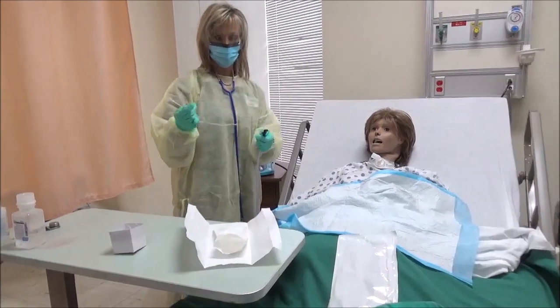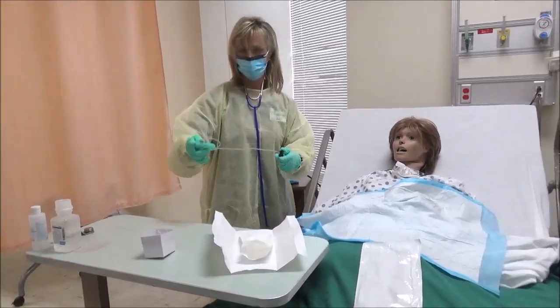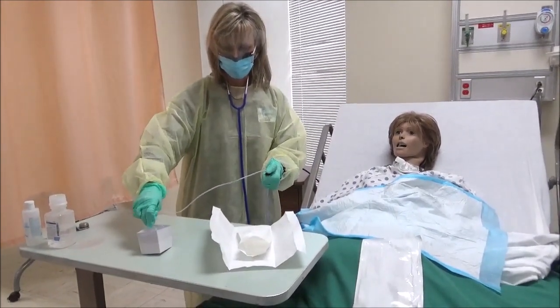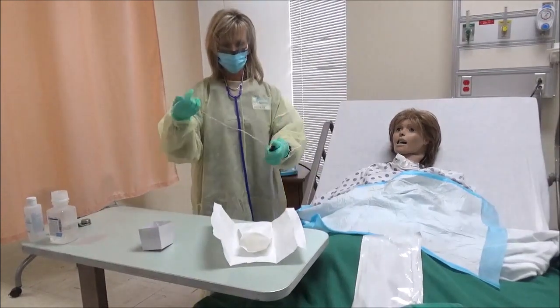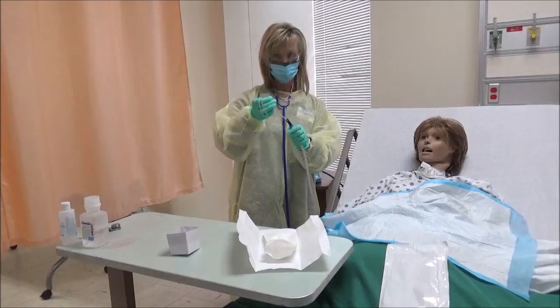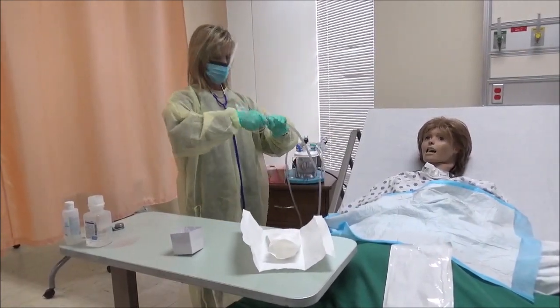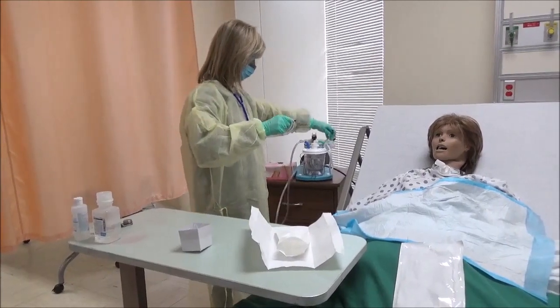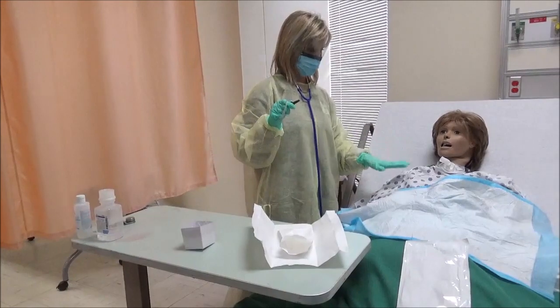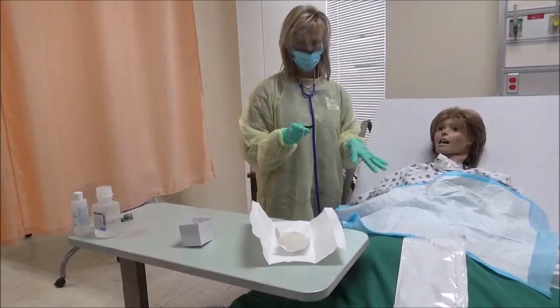I want to make sure that the sterile part is over, so I can make sure that this is cleared out of any secretions, because you don't want any dried up secretions getting in your suction catheter and getting all clogged up for the next time that you need to use it. Disconnect that, unhook this. Constantly assessing my client, looking at their color, their respiratory rate, their oxygen saturation, making sure everything is fine.